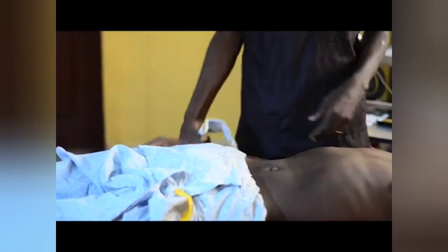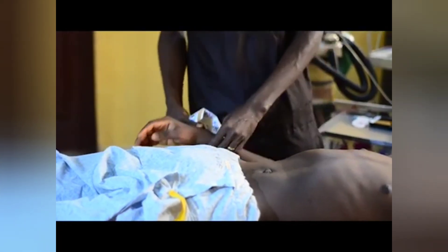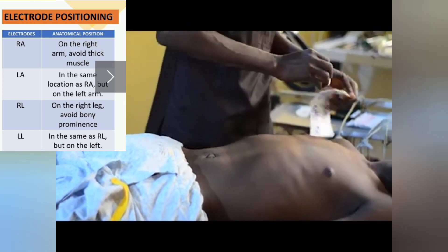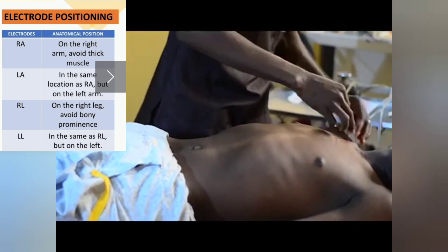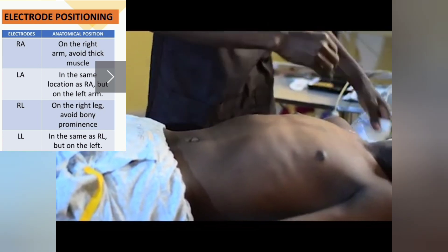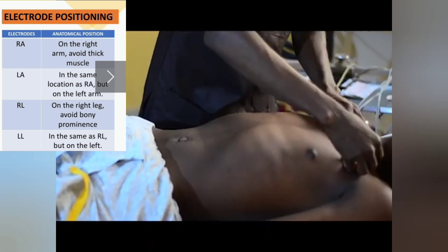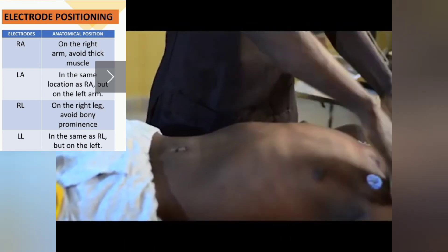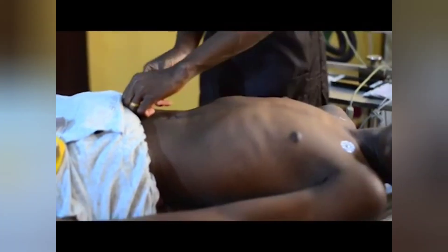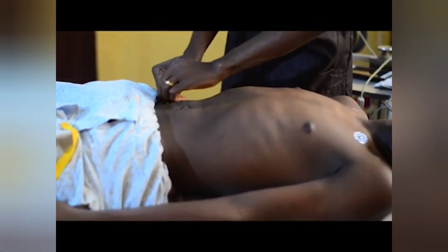For the right arm, you can use any part of the right arm starting from the wrist, but for the purpose of this video I will be using just below the clavicle. For the left arm I will do the same, just below the clavicle. I have seen people putting it above the clavicle — try and place it below the clavicle to avoid interference.